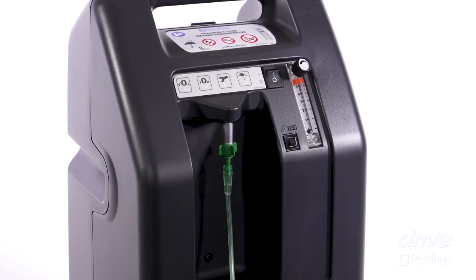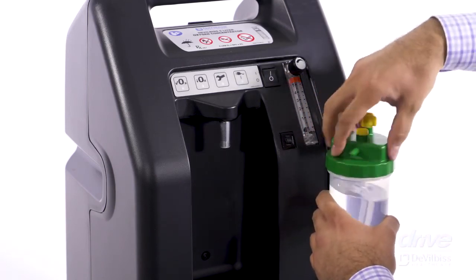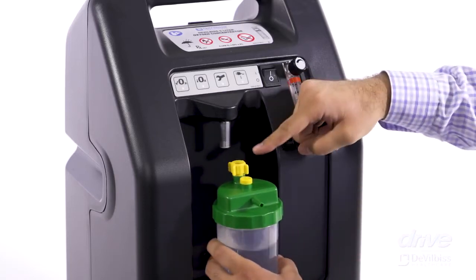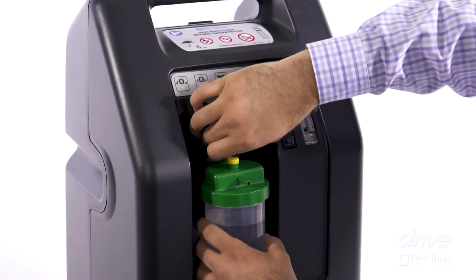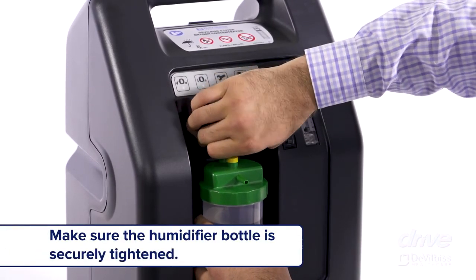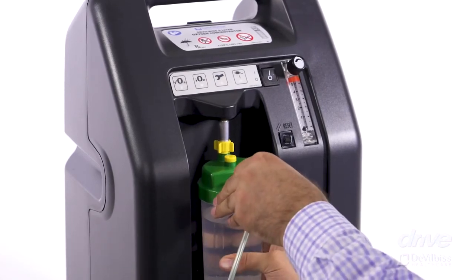If your physician has prescribed humidification as part of your therapy, the oxygen outlet connector is not needed. Fill your humidifier bottle with distilled water and place the lid back onto the bottle. Thread the wing nut on the top of the humidifier bottle directly onto the oxygen outlet. Attach the oxygen tubing directly onto the humidifier bottle oxygen outlet.